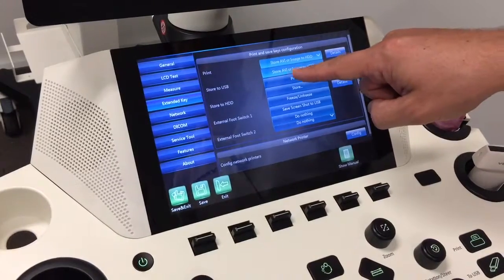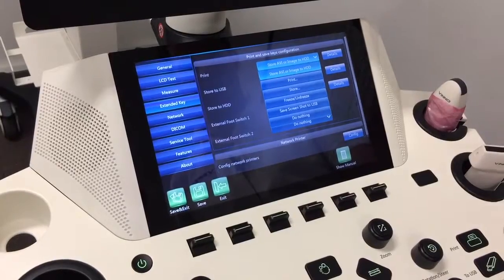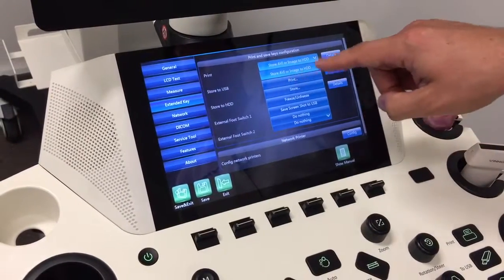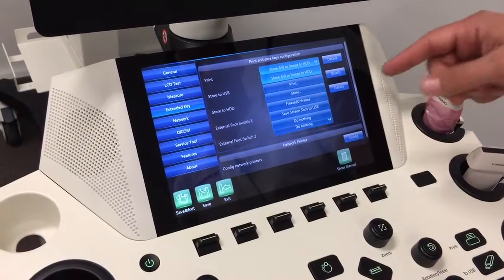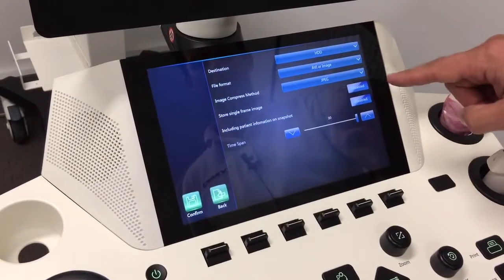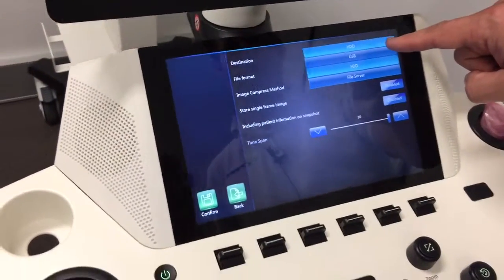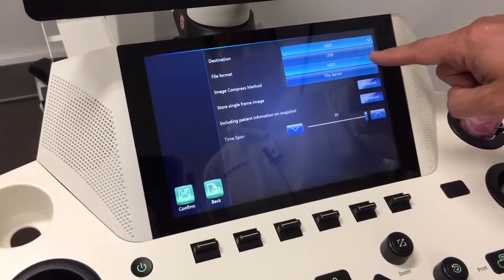At the moment we've got it to store an AVI or an image to HDD, so it's going to store it to the hard drive, and AVI and image files are going to be playable back on a computer. So if you go to details, you can set up exactly how that's configured. At the moment we've got it storing to HDD. You could send it to the USB or a file server if you have it connected.